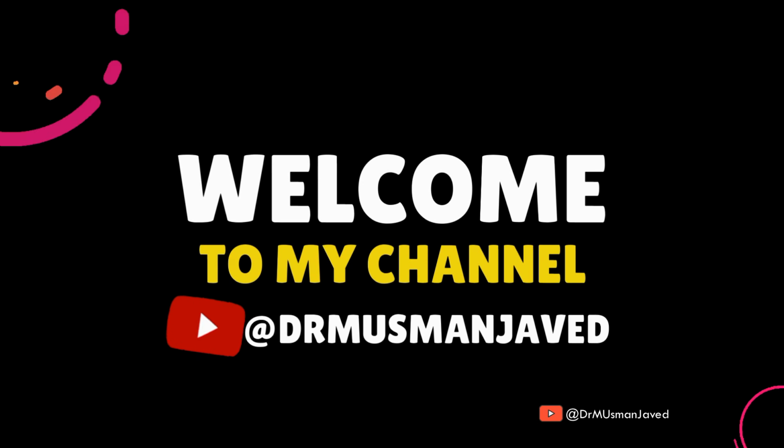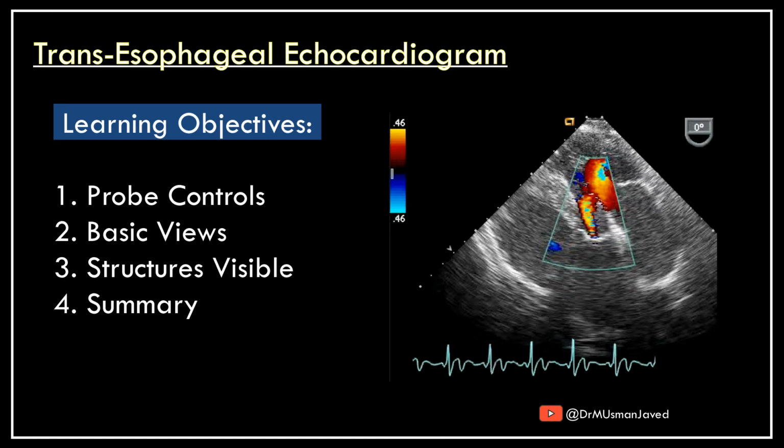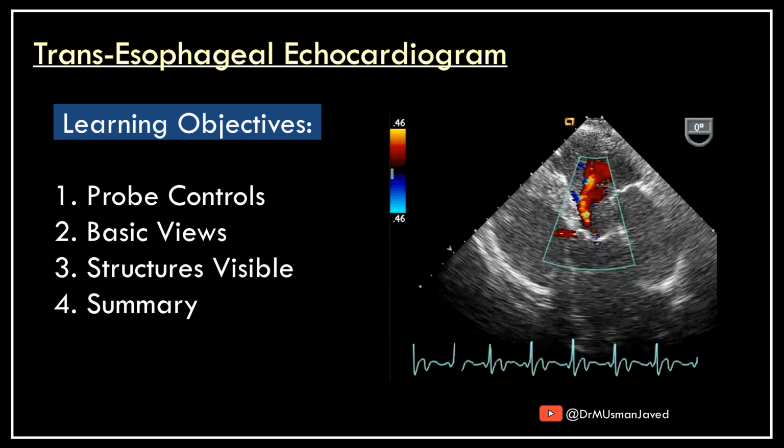Welcome. In this video we are going to review the basic views of transesophageal echocardiogram and the structures visible in each view.